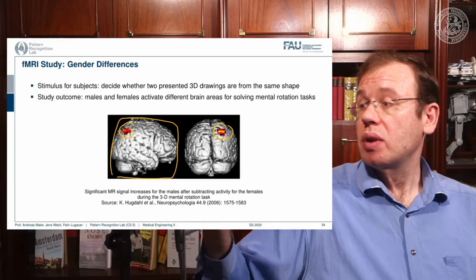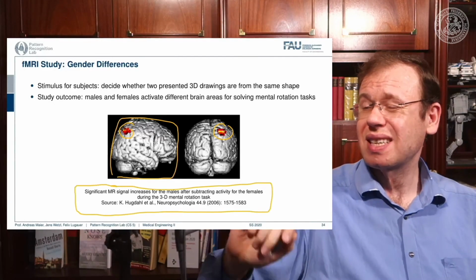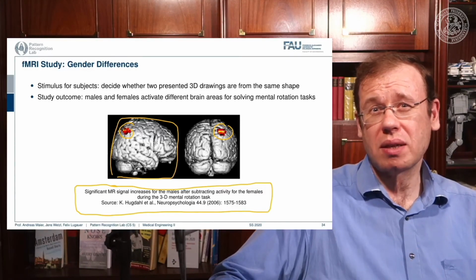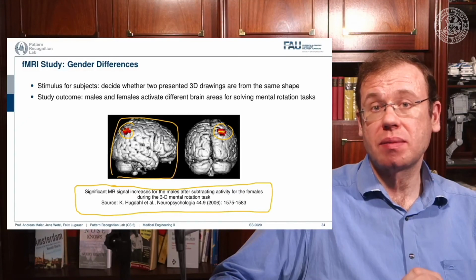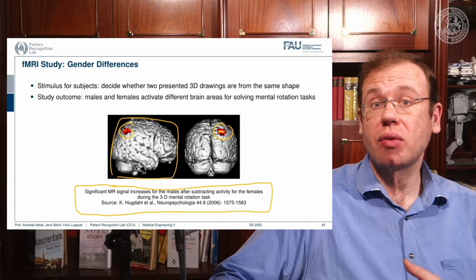If you then visualize these things, because the signal is rather low, you can't just pinpoint for a specific individual where the actual oxygen was used. You need to do many measurements, and then what's often done is that you average over groups.